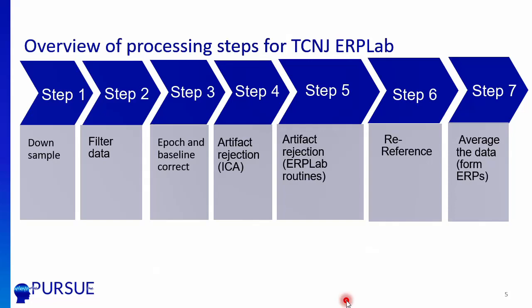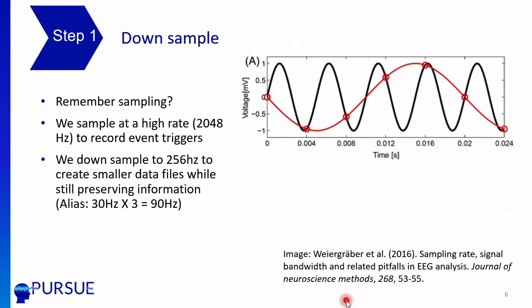So the first step, and maybe I could even put in, the first one would be to import the data file, but we'll just sort of assume that that's already going to take place. You have it in MATLAB. First thing we're going to do is downsample.